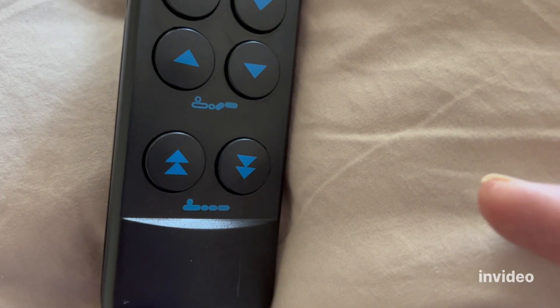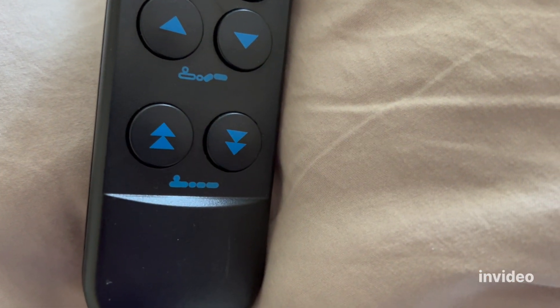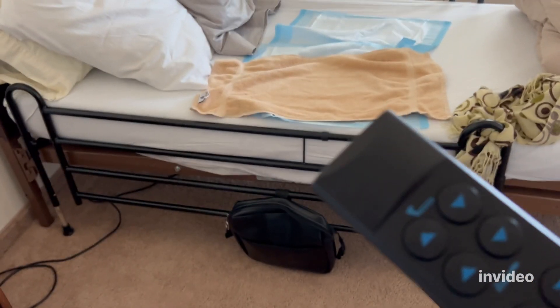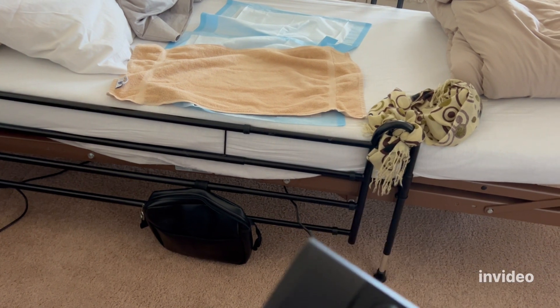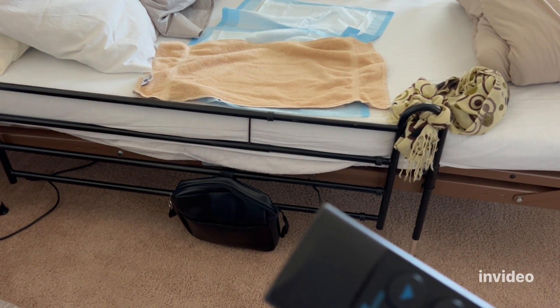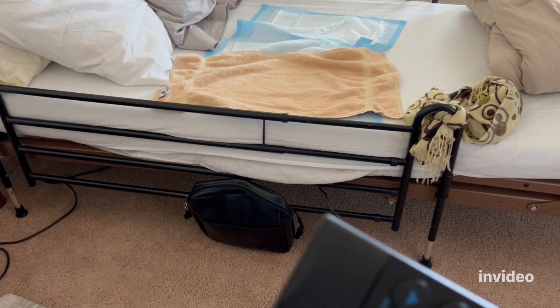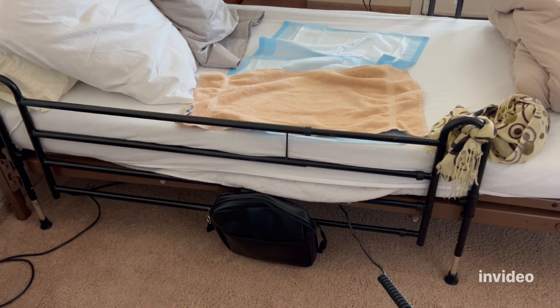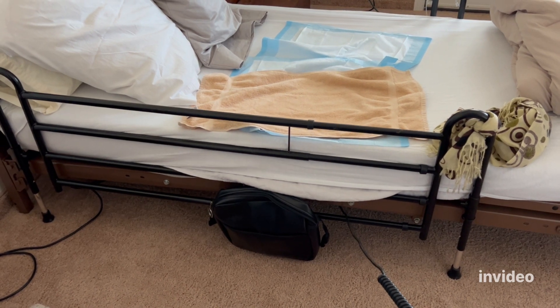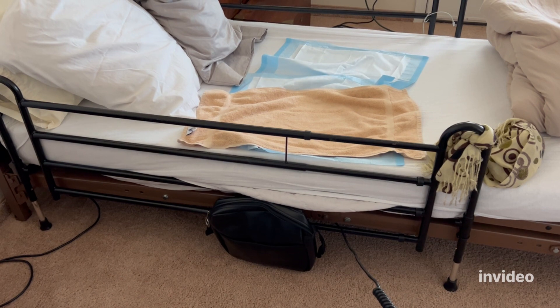The entire bed platform can be raised or lowered. As the rail is no longer attached to the platform, lowering the platform makes the rail rise in relation to the mattress. The rail is stationary on the floor, but as the bed goes down, the rail in relation to the bed raises.